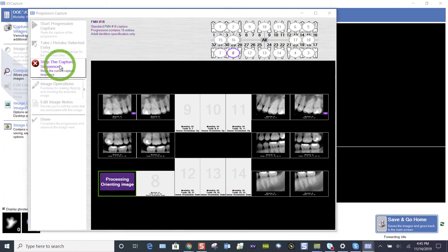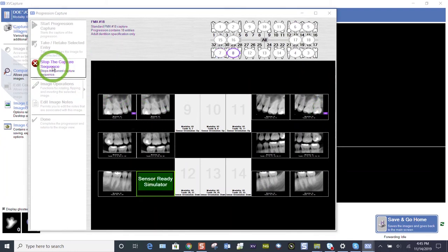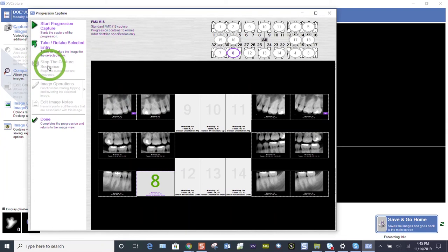So I'm going to stop the sensor. My simulator moves so quickly. Your sensor will be ready for five minutes per image. You have five minutes per image. So if the sensor times out, we're going to be looking exactly what we're looking at right now. If your patient has to get up and leave the room, go to the bathroom, take a phone call, and they're out of your room for five minutes, or if we are pulled away from our patient, that sensor will stay ready for five minutes.